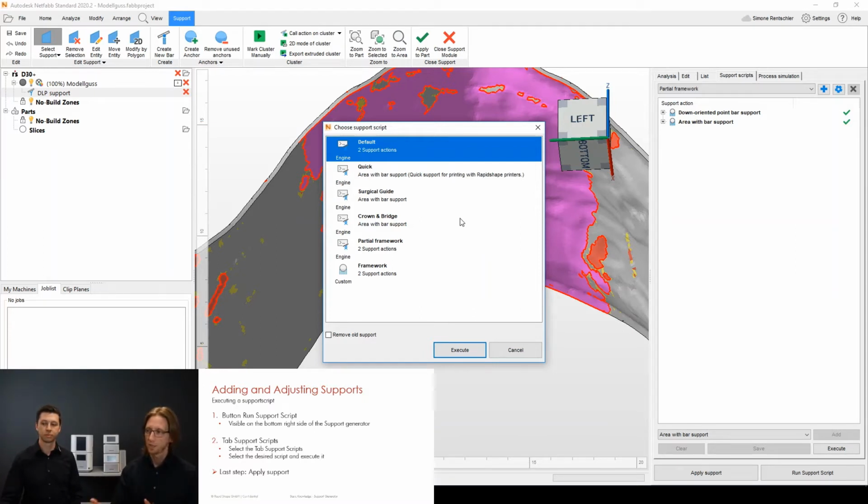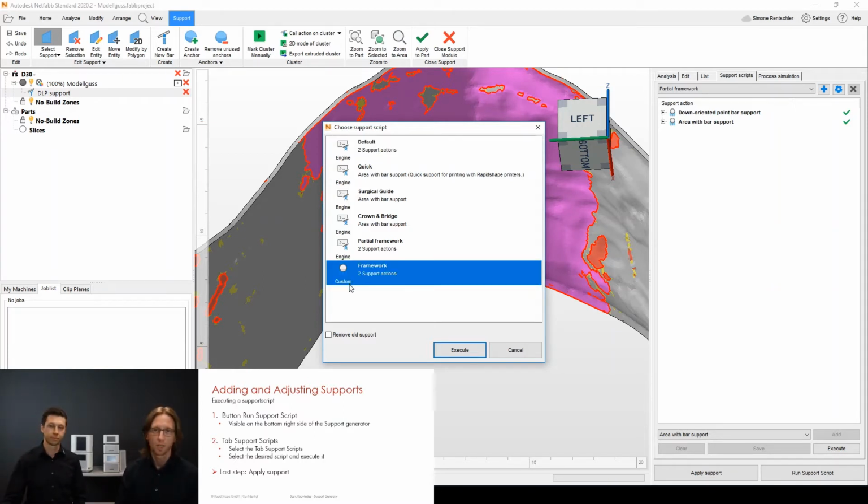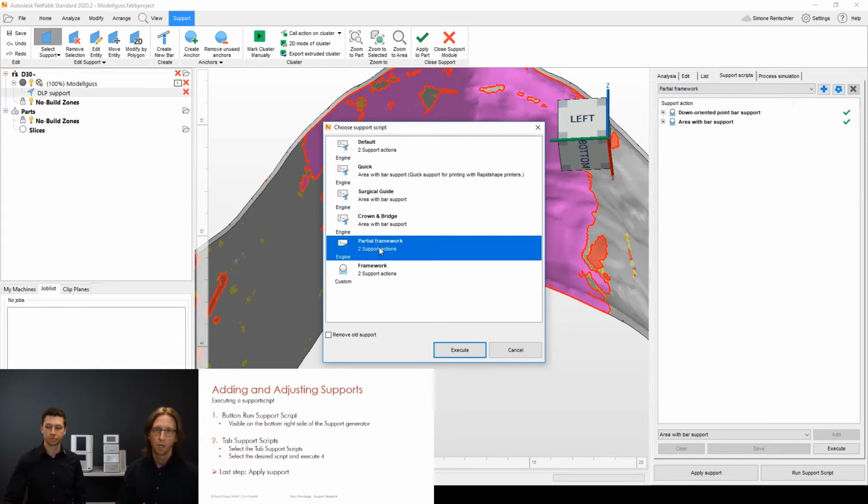What you can see here is that a couple of those, or most of them, come with the rapidshape engine. And only one of them, which we just have for testing purposes, was created by us. This is mentioned here as custom. Then again, you would just select the partial framework. So this is the default one we delivered with the engine. And then you just hit the button execute. You can still say, yes, I want to remove old support if there are already old supports in there. Or you can just disable this function, and then you would just add the support script to the existing supports you have already for this part. Again, you just hit execute, and this is it. Well, so these are the 2 ways.